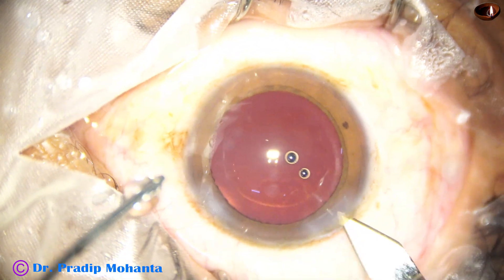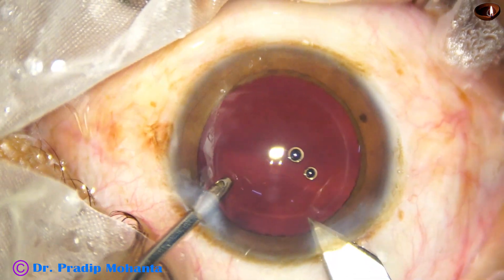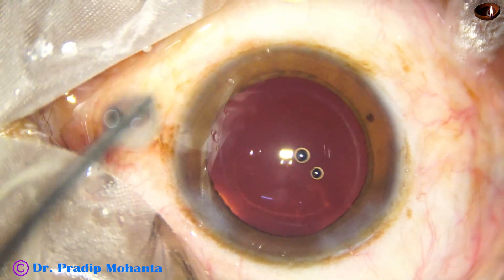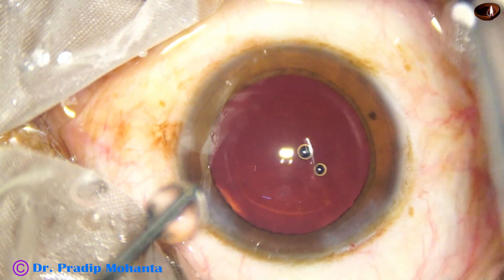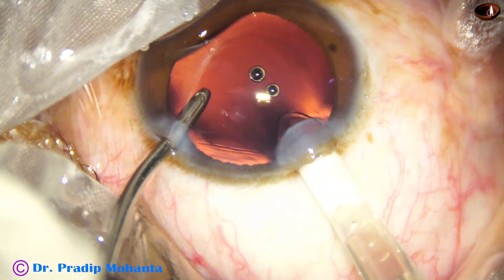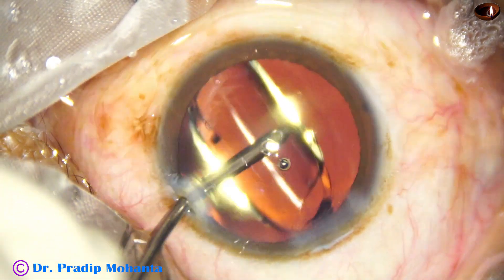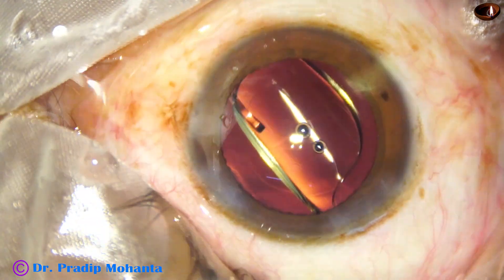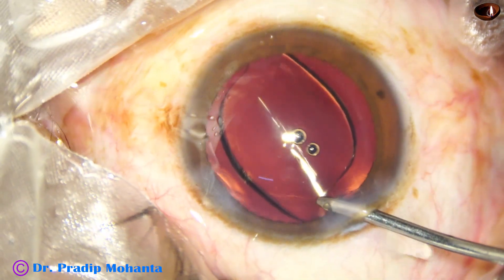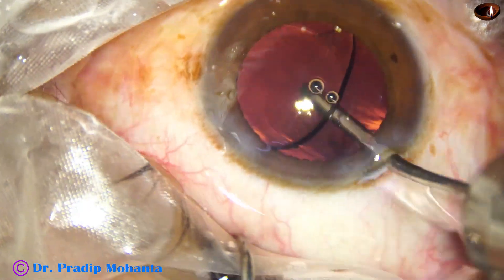And now I enlarge the main wound because I am going to use a B cartridge — enlarge the main wound by a cut. Now the size of the main wound is about 3 millimeters. Now here goes the single piece, monofocal, aspheric, hydrophobic intraocular lens. The lens is placed in the bag and now the irrigating probe is used to wash out any visco that was in the lumen of the cartridge.